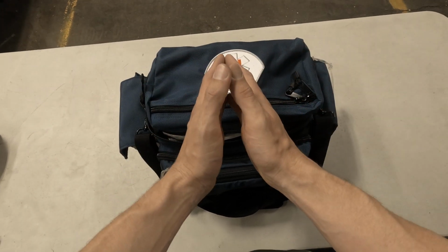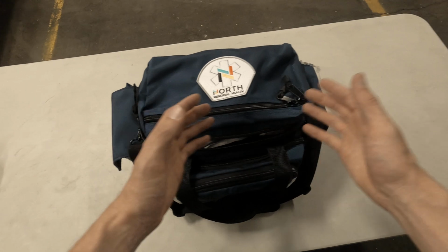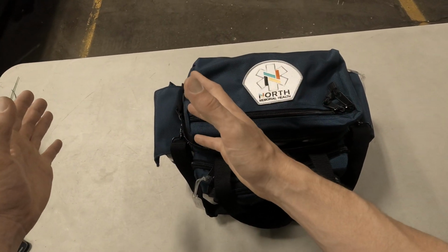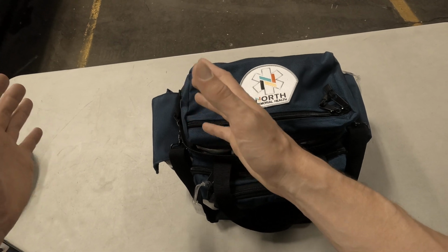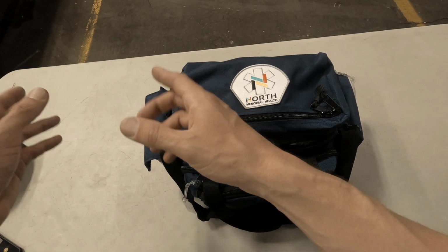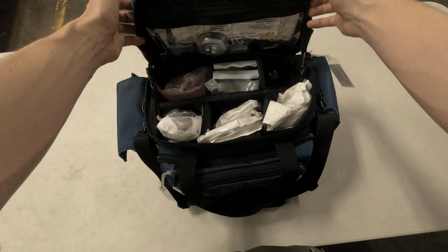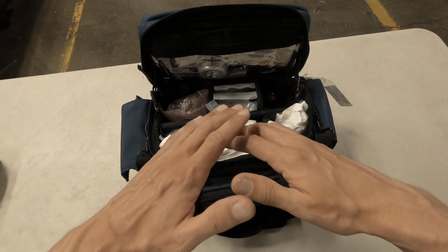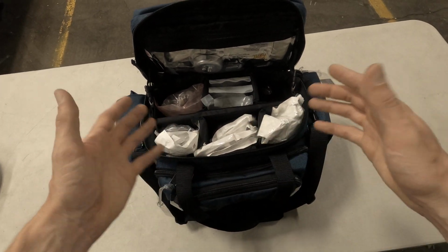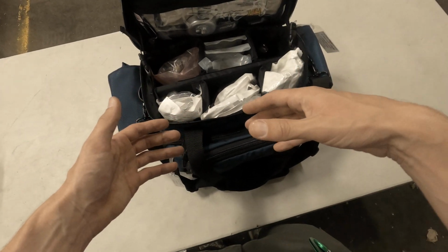So the reason that we split the critical care equipment into a black bag and a blue bag was to try and focus a lot of the gear and equipment that we would most likely need immediately on a scene into that first in bag, the black bag, which is in another video, and relegated everything else into the blue bag, the stuff that you would rarely ever use, or you would need either down in the truck after you get everything set up, or if you had a little time to actually go back down and grab it.